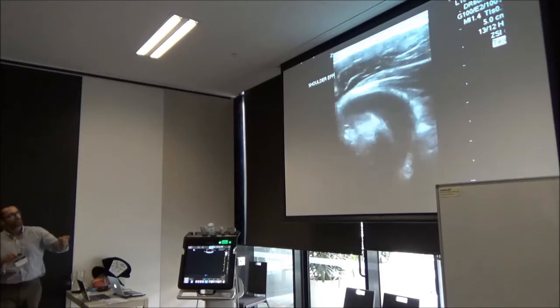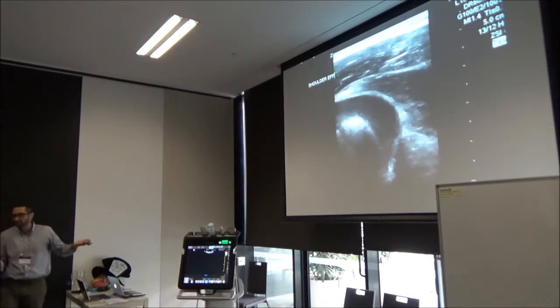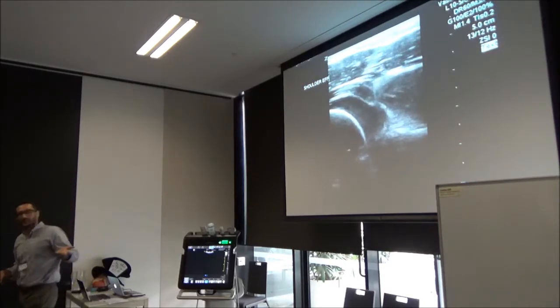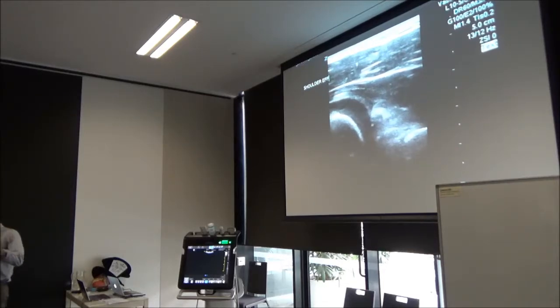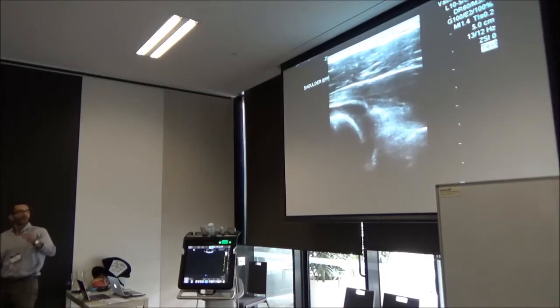She used a linear probe, which I love. Let's say I have an effusion. She used a different type of probe, which is okay. Whatever. She sticks a needle in and pulls gonococcus out of the shoulder, which I thought was pretty badass. I literally taught this lady a day before. She puts a needle into it, gets gonococcus, and actually published this as a case report in our Annals of Emergency Medicine as a video case. I was so impressed. She sends it to me via email and says, oh, I had this case yesterday, thanks for showing me the shoulder. Nobody else could do it.